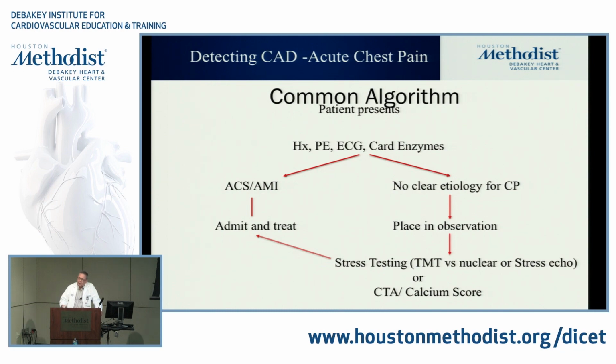But more recently, the whole era and the whole use of CTs, CTAs, is really making a very strong move. And Dr. Nabi will cover that. And there are trials now, randomized trials. So this is now becoming kind of like the new kid on the block to manage chest pains in the ED.